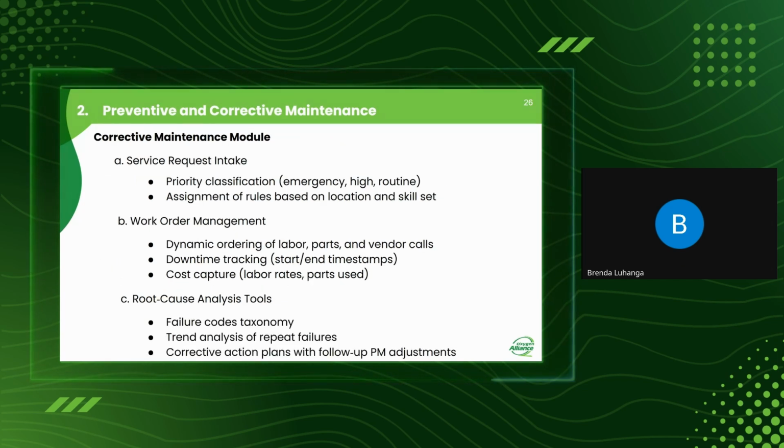For corrective maintenance, creating a schedule usually starts when you have received a service request, like from users, or you have received issues of breakdowns on certain medical equipment. So this usually starts when you have a service visit. Then if you have a lot of issues or maintenance to do, you will start with prioritization.